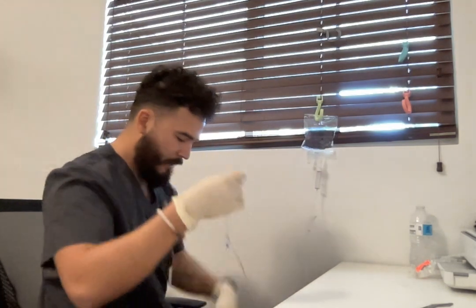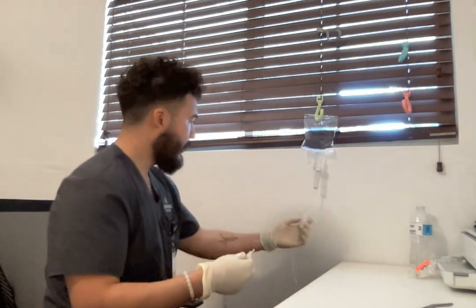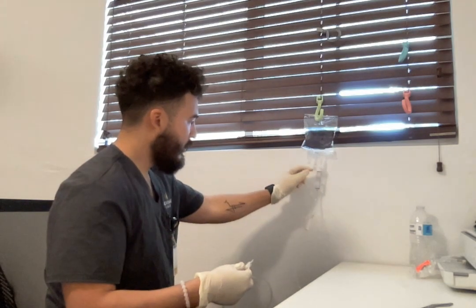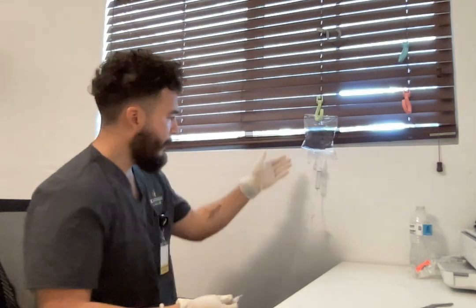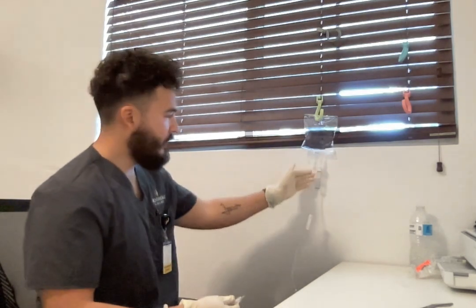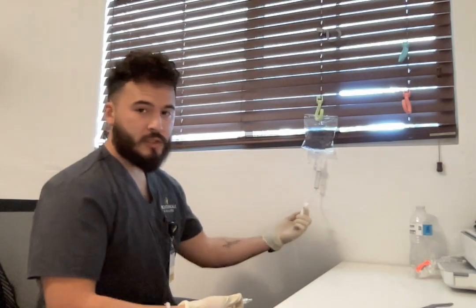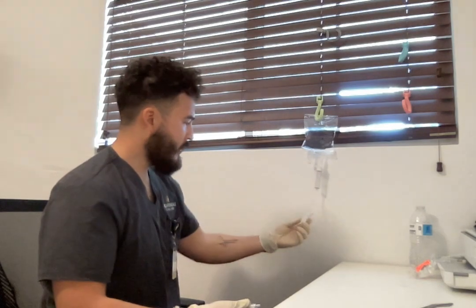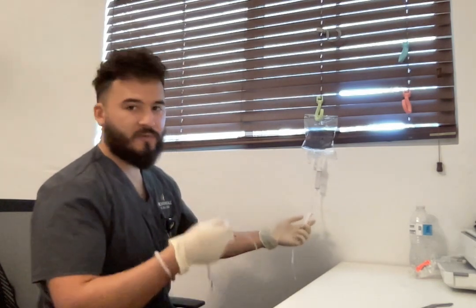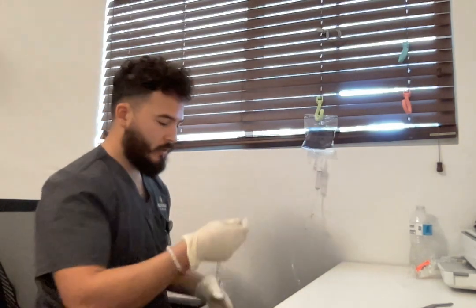All right, now that I have removed all the air from the lines, I'm going to unclamp this and then count 38 drops for a full minute. So every minute, I want to see 38 drops in this drip chamber. For the sake of the video, I'm not going to count an entire minute, but I'll unclamp this, and then to ensure 38 drops, I'll adjust it until I have 38 drops for a full minute. But for the sake of the video, let's just assume that I have 38 drops already right here.